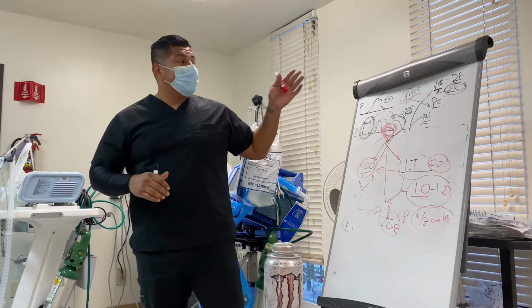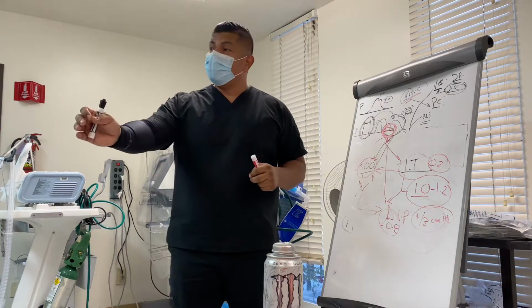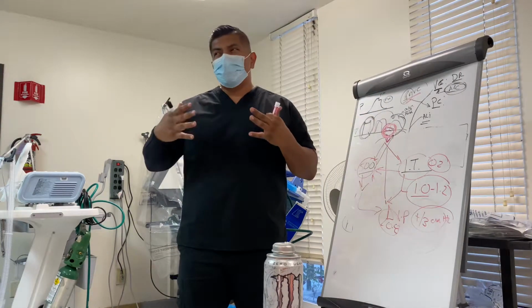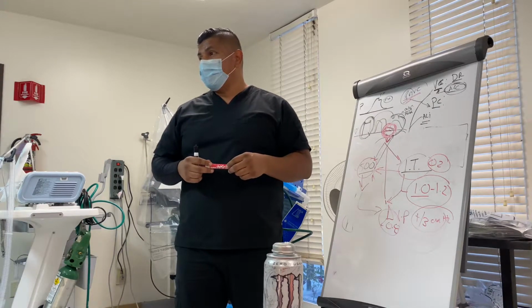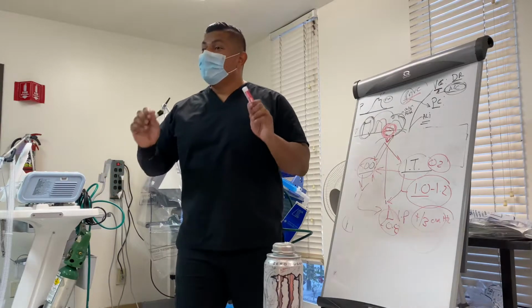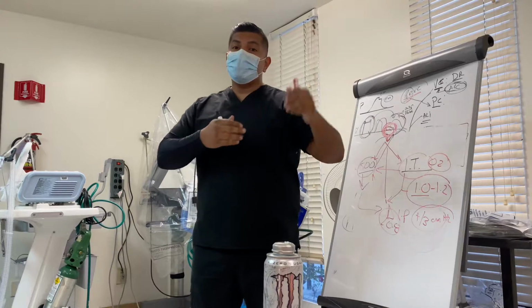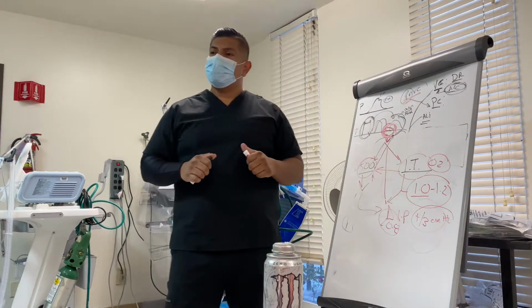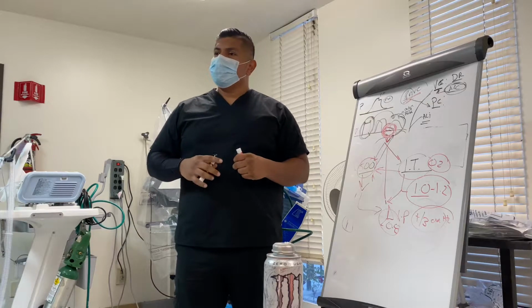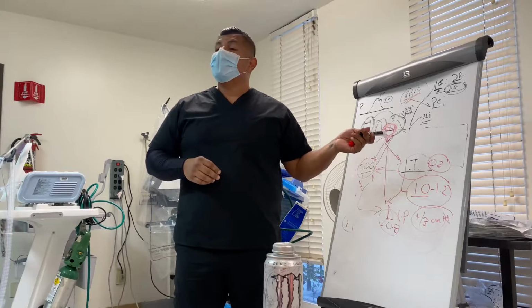So this PRVC is ideal for patients that you just intubated, patients whose lungs you really want to minimize injury to, and hope to get them off the vent as soon as possible. Now I know it's really hard to say that here, but prolonged or long-term minimal injury is always ideal. So is it safe to say that hemodynamically unstable patients would benefit more from PRVC? Yes.